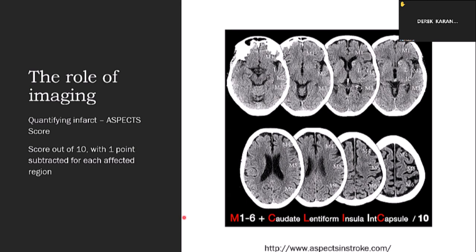Oh, I see. Okay. And the other thing was, we've had some cases where this really throws the rads, and we're tearing our hair out saying, well, the perfusion is telling you thrombectomy is indicated, yet there is no vascular occlusion anywhere. You're talking about cases where there's a large area of apparent ischemia on perfusion imaging with no large vascular occlusion, correct? Yes. Why does that happen? Because the perfusion is saying thrombectomy indicated, but there is no clot. So is that slow flow, or are we missing pathology?